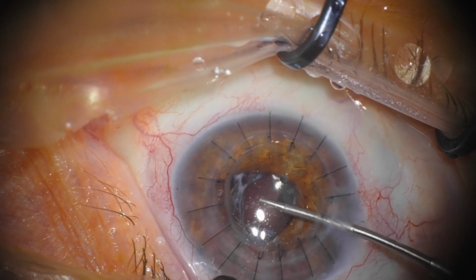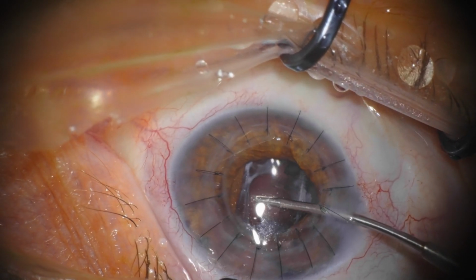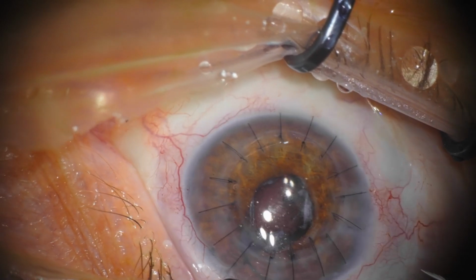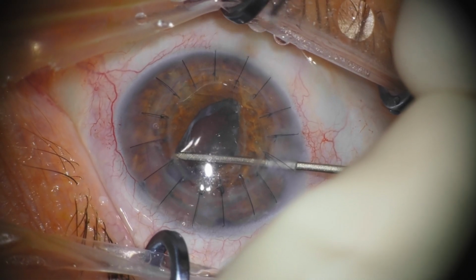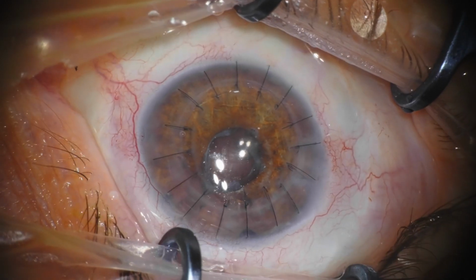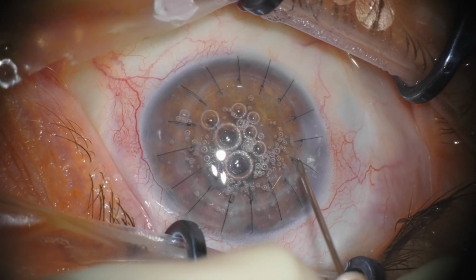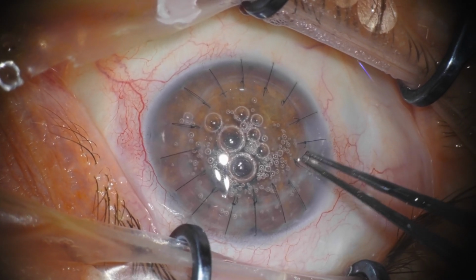Then the IOL implantation is done under viscoelastic, especially being mindful to inject viscoelastic behind the iris and anterior to the capsule so as to create the sulcus. And then with intraocular forceps, we simply place the haptic inside the sulcus, and then we rotate it. We rotate the whole IOL, and then we inject some more triamcinolone simply because we want to check for vitreous, and we take out the suture.